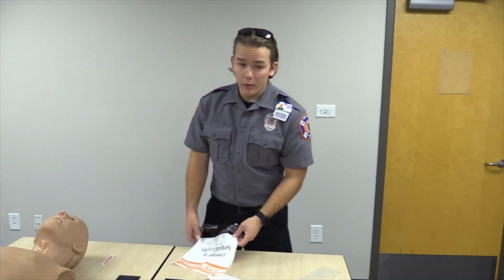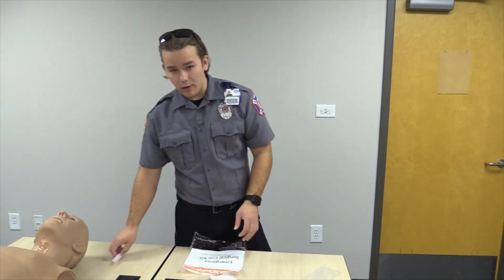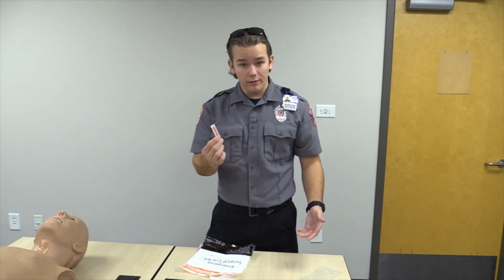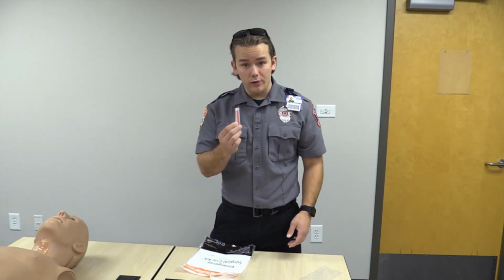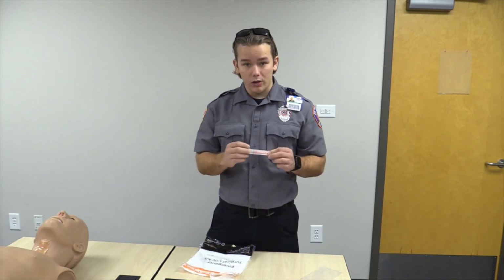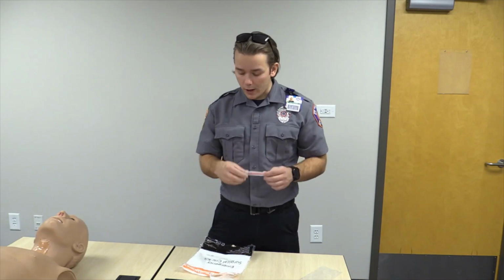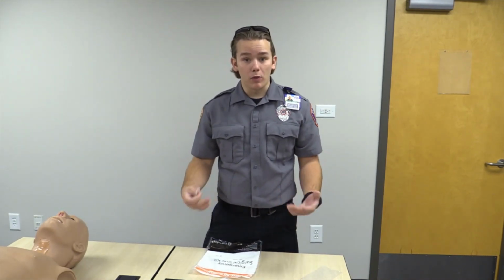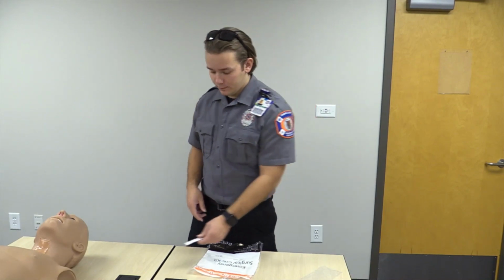One really important thing I want to point out is this does not have our standard 18 gauge needle in here. Okay, if you have to use this procedure, you're going to have to pull this out of your IV tray, your needles tray, whatnot, and make sure that you have this to begin the procedure. Again, I just want to break this down for you and show what we have before we actually use it. Okay, thank you.